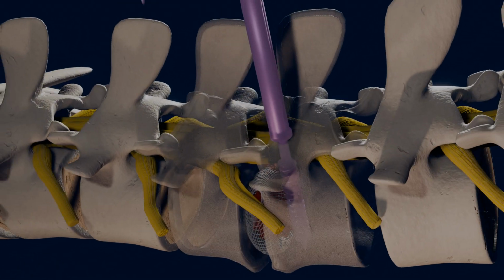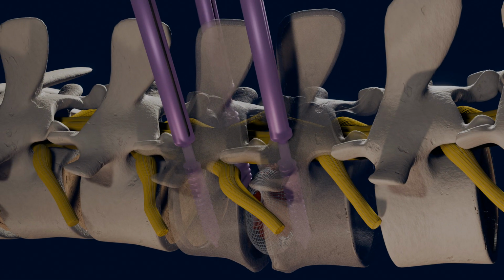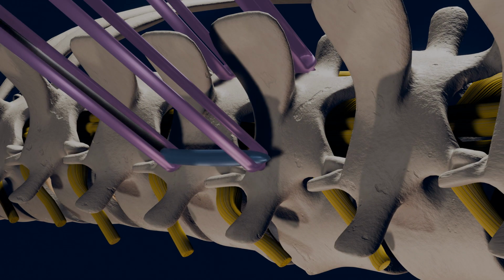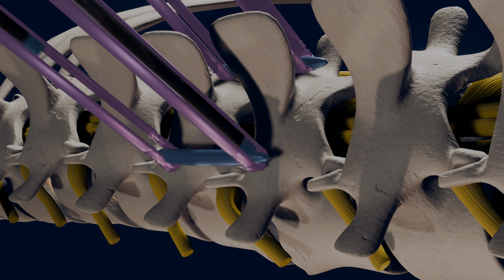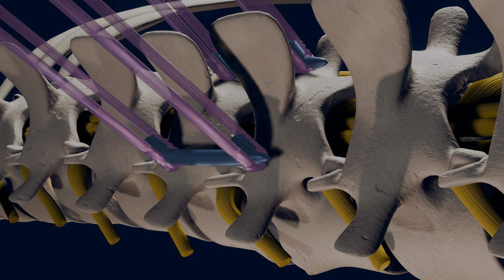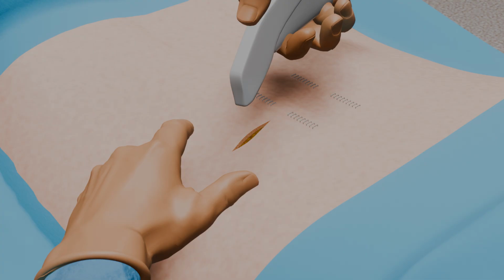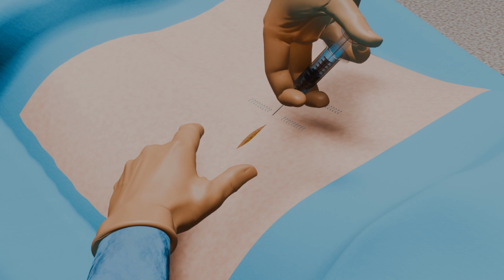The process is repeated for 3 more screws. Each pair of screws on either side of the disc is then connected with a metal rod. The rod is secured to the screws with a locking screw. Screw guides are removed. Again, neurophysiological monitoring is used to help in prevention of nerve injury. After completion of the procedure, your incisions will be stapled and a sterile dressing applied. A local anesthetic solution will be injected to help with postoperative pain.